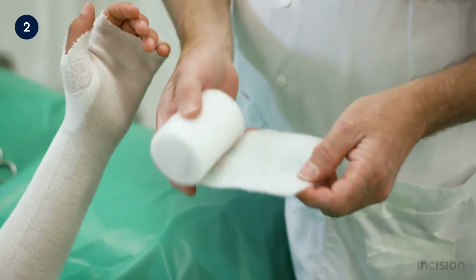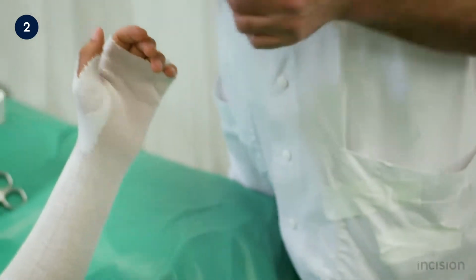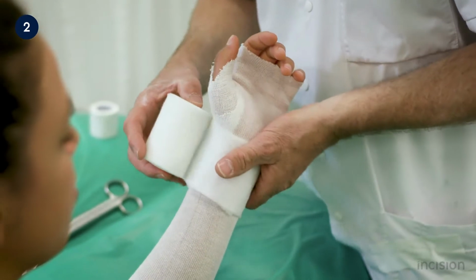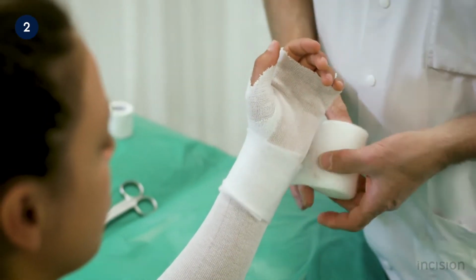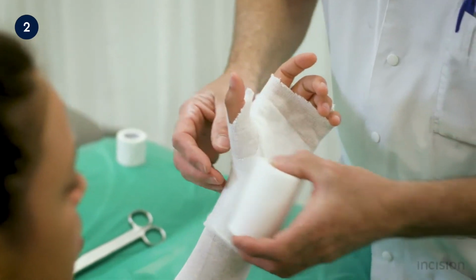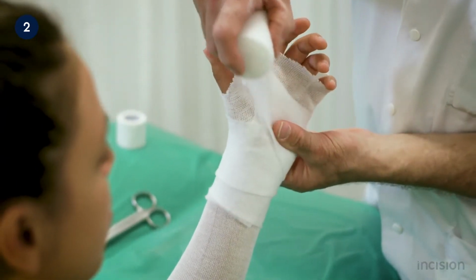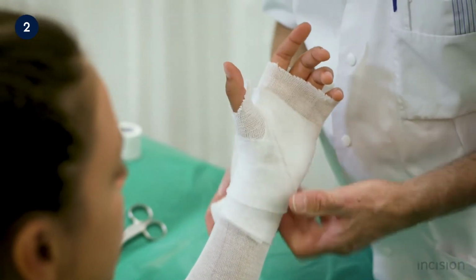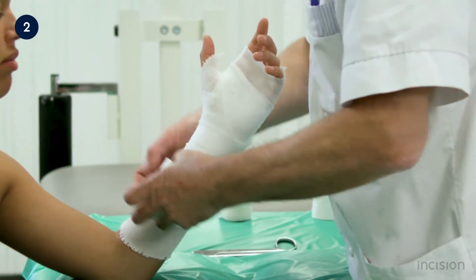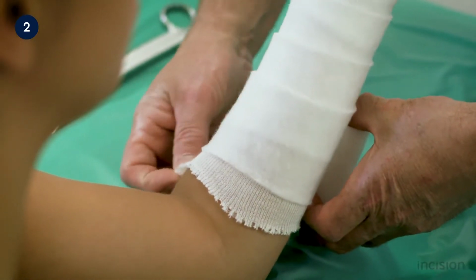The flat part of the roll should be applied onto the limb, allowing for easy unrolling. The application is started by encircling the wrist joint twice, making sure to include the ulnar prominence. It is then placed through the first web space, over the wrist joint, and again through the first web space. The padding is unrolled further proximally until the entire forearm is covered. Note that each turn of padding overlaps the preceding one by 50%.